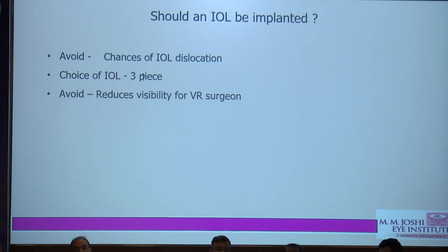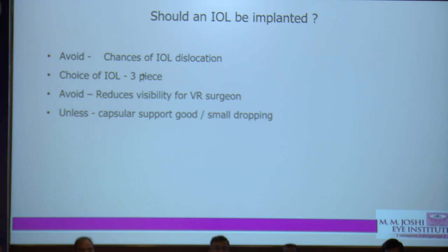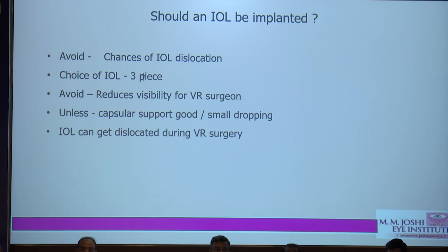Putting the IOL in sometimes shakily, we have seen that it obstructs us from doing a complete vitrectomy, especially when we are doing a PVD induction. So if possible, try to avoid it. And if the capsular support is really good, with a small capsular drop, then I advise to straight away go and put an IOL, no need to bother at all, and then send the patient to vitreoretinal surgeons and let them manage that cortex piece. I'll come to that a little later.